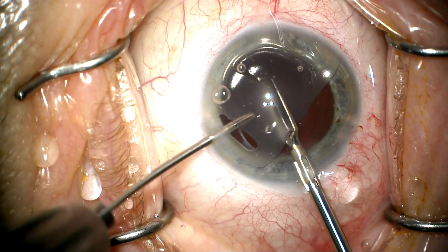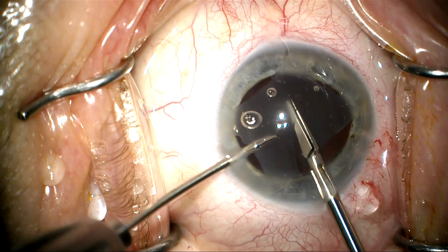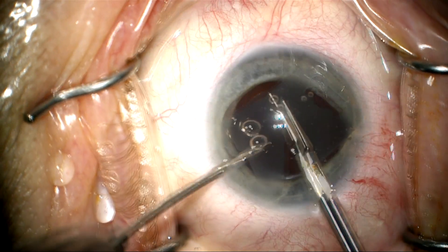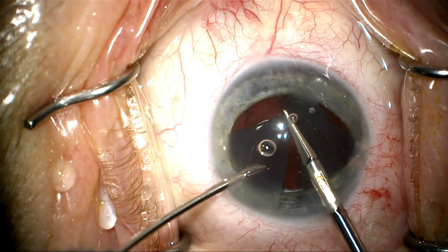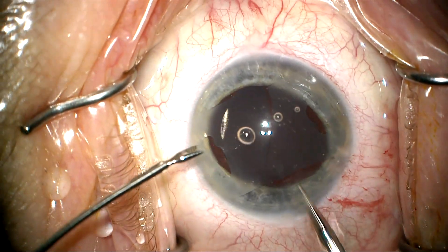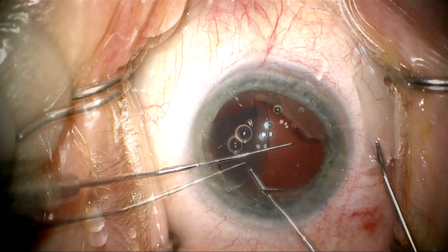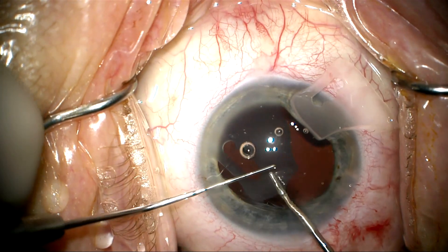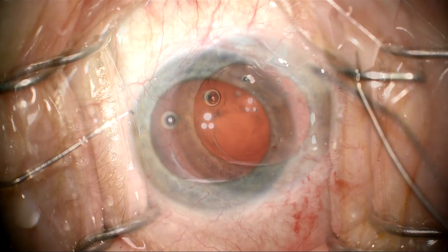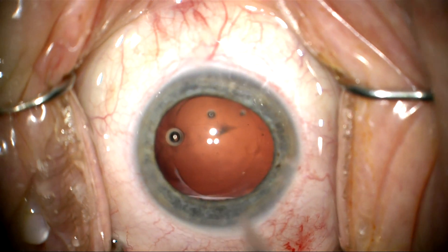Here we're holding the lens, and it cuts very easily with the 19-gauge Packer-Chang micro scissor. We go completely through the lens and can remove it in two pieces quite easily through the relatively small incision. I'm going to protect the back of the cornea as I pull this out — that's something I always do to make sure nothing kicks up and hits the endothelium.